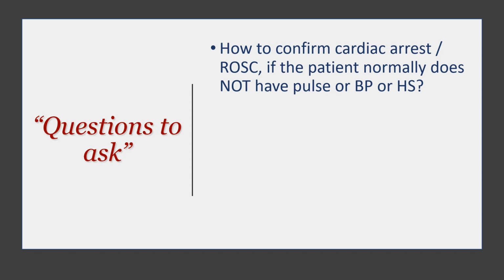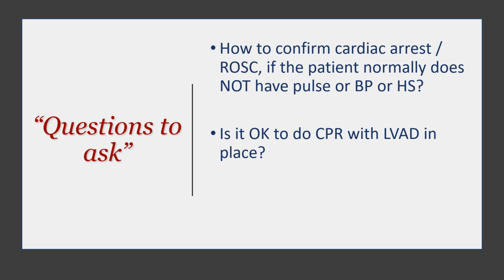That's the first question. The second question is, is it okay to do CPR for a patient who's got an LVAD in place? This is a device that is attached to the heart, connecting the left ventricle to the aorta. How about the mechanical compression there? Can this cause any dislodgement or cause any harm? So that's the second question.